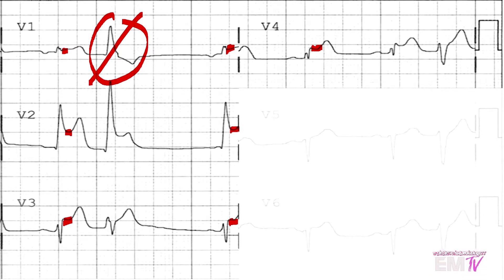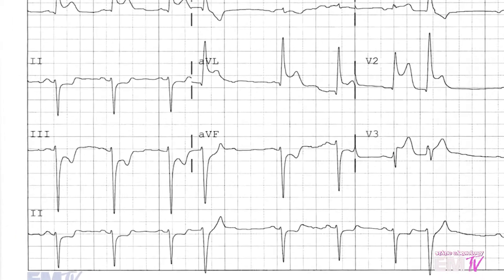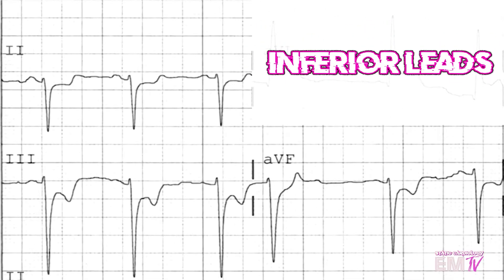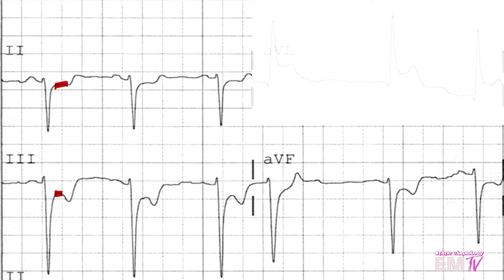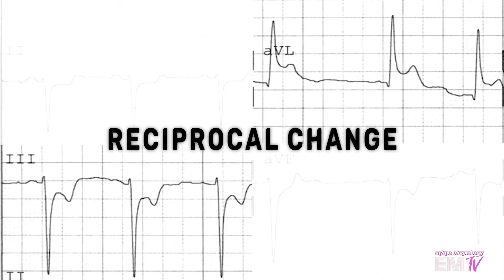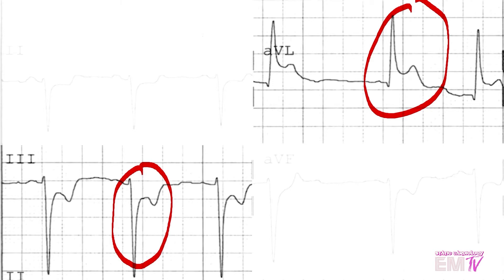Very, very concerning. Let's go ahead and take a look at the inferior leads next. In my inferior leads — leads 2, 3, and AVF — I'm seeing significant amounts of ST segment depression. However, if you look at lead 3 and AVL, this is what's known as a reciprocal change. What that means is you are seeing an exact mirror image of lead 3 and AVL. This is very concerning for a lateral MI. Let's go ahead and take a look at those leads now.